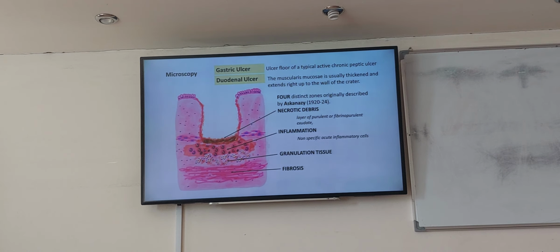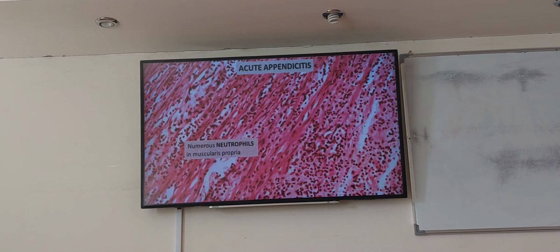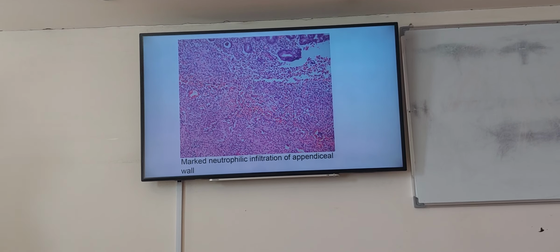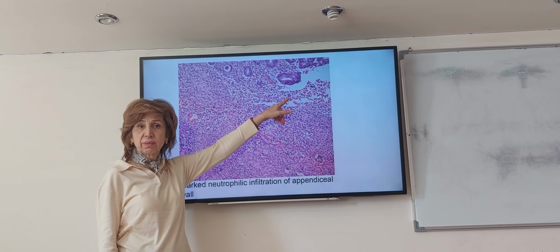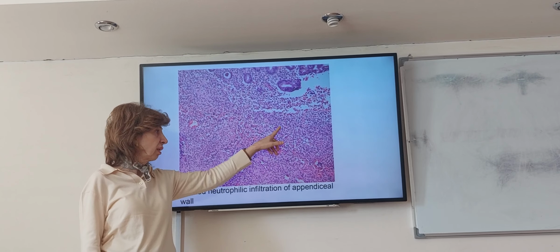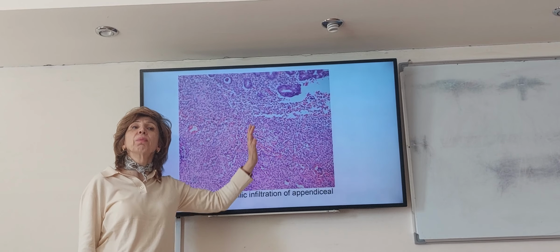Okay, so I will put the appendicitis and look at it, and tell me, what do you see? Do you see any capillaries? No, just ulcer and just neutrophilic infiltrate. This is acute purulent.